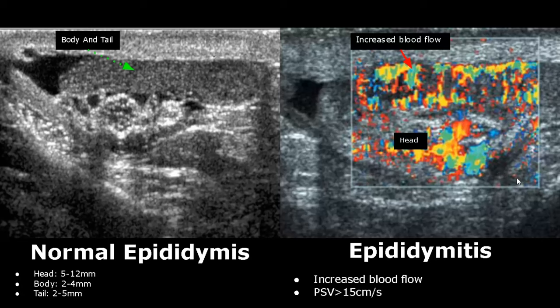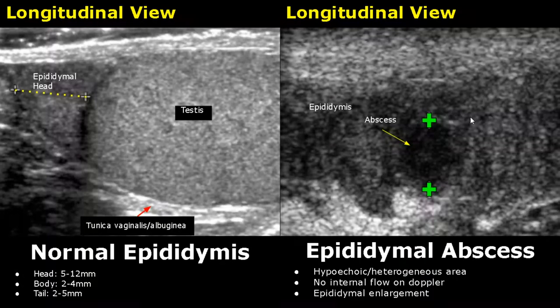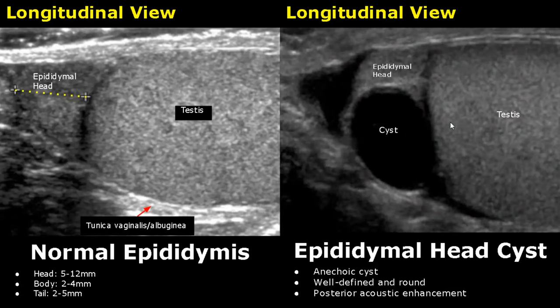In an epididymal abscess there will be a hypoechoic or heterogeneous area with absence of any internal blood flow on Doppler, and the epididymis will be enlarged. Epididymal head cyst is seen as an anechoic, well-defined round cyst in the epididymal head with posterior acoustic enhancement.